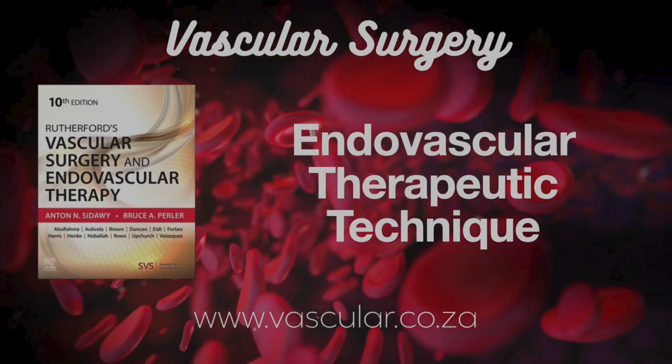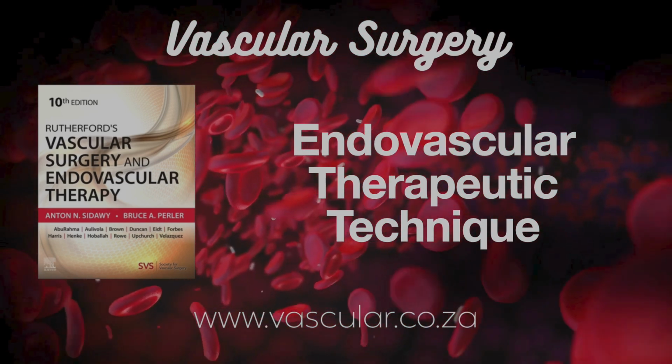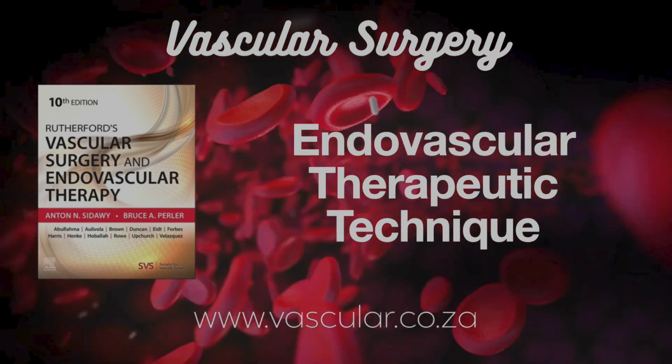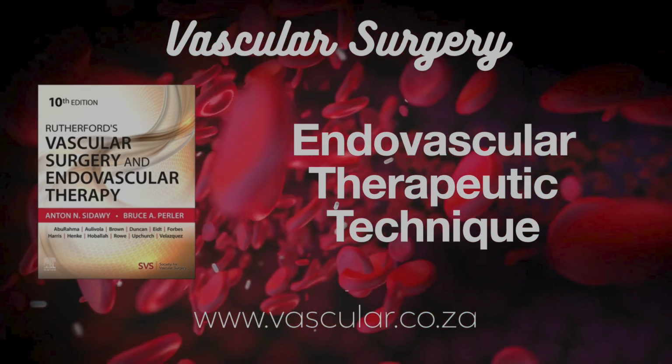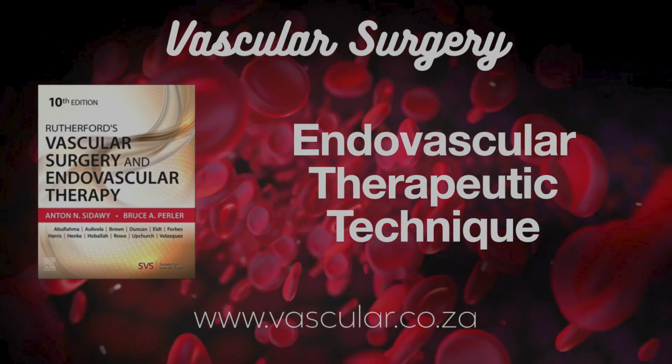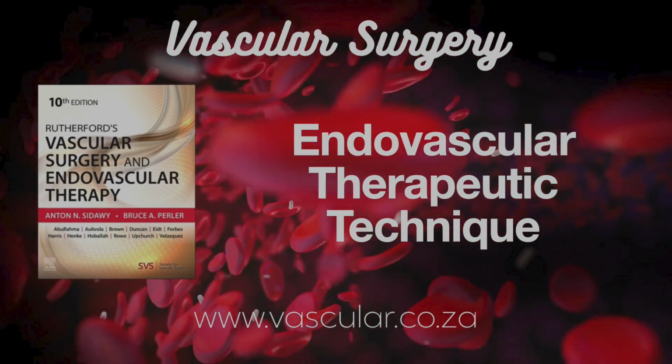Inflation time and pressure. Prepare the balloon first: flush air, fill with dilute contrast for visibility. Center the stenosis. Avoid overinflating past reference diameter. Longer inflations, maybe 180 seconds versus 30, might improve results and reduce dissection and bailout stenting, based on Zorger's study.